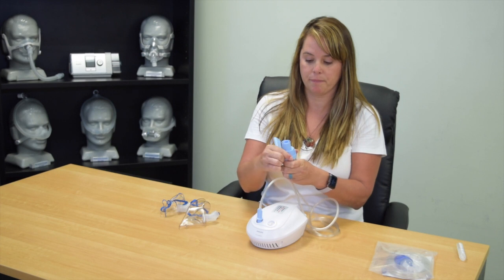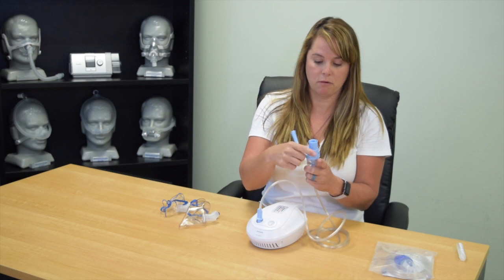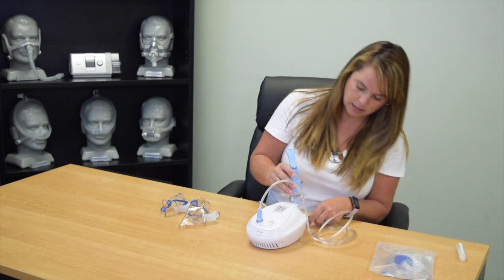for that treatment. When you're done, you're going to take your kit apart. You're going to rinse it out. You're going to let it air dry. And then you can store it right on your compressor until the next one.